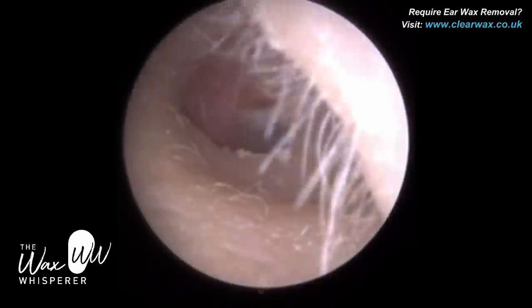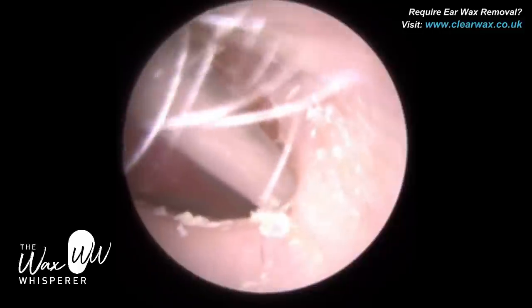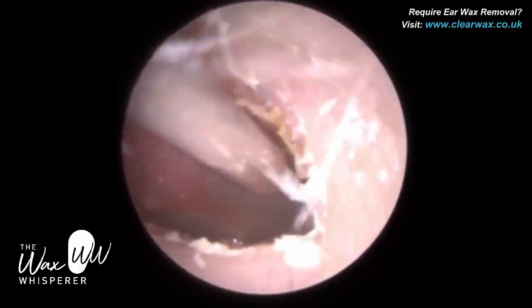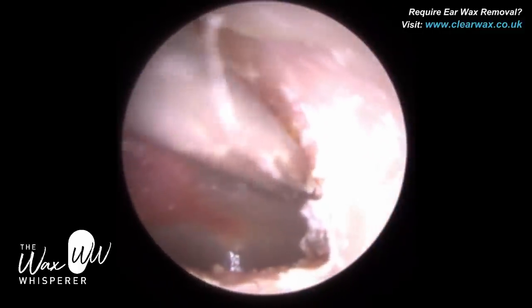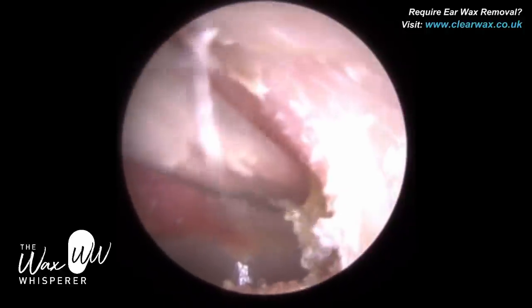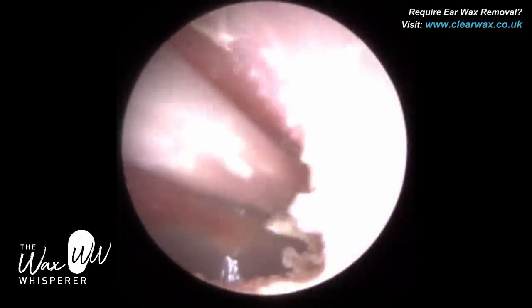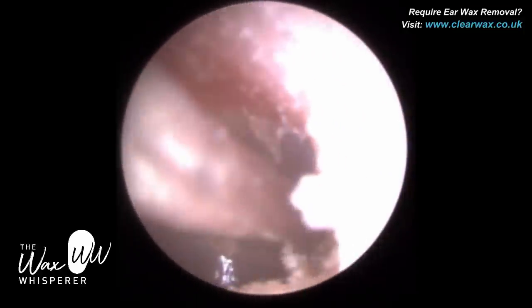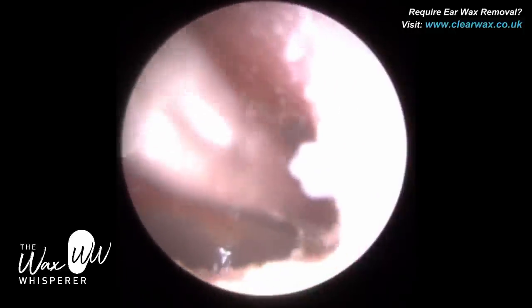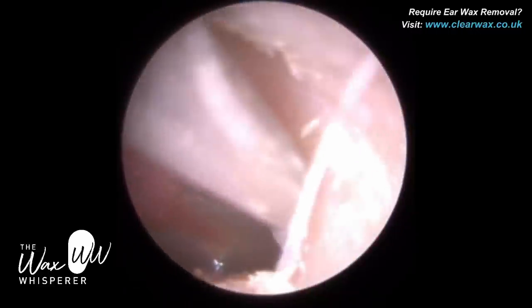We want to avoid making contact with the bony part of the ear canal — it will be quite painful for the patient. In terms of how to describe the pain: imagine your tooth enamel and roots are exposed and you make contact. Your teeth are very sensitive and you have a cold drink or ice cream — that kind of acute pain is what patients often experience if you make contact with the bony part of the ear canal.